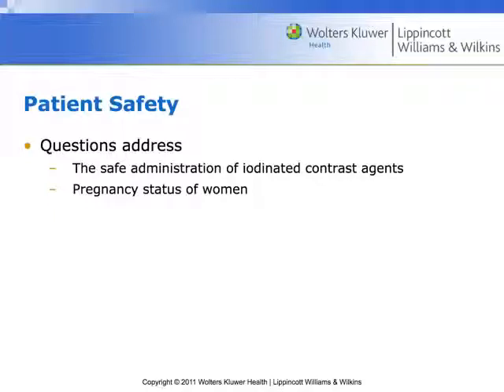In addition to the pregnancy status of a woman, I'm also interested, are you lactating? Are you nursing right now? Because if so, the iodine that I'm going to give you is going to show up in your breast milk, right? So we'll talk a little bit about what that means.